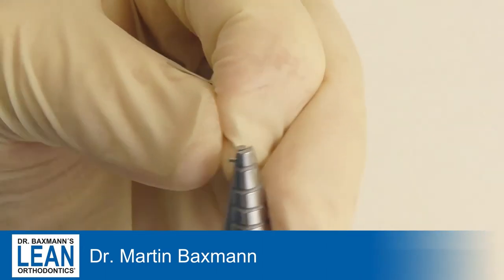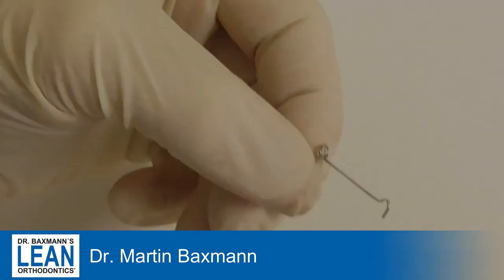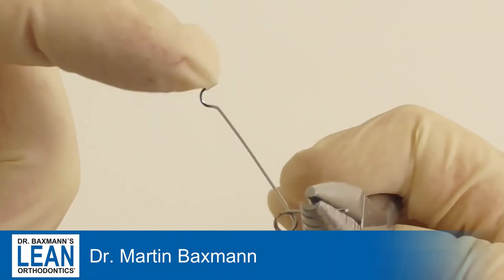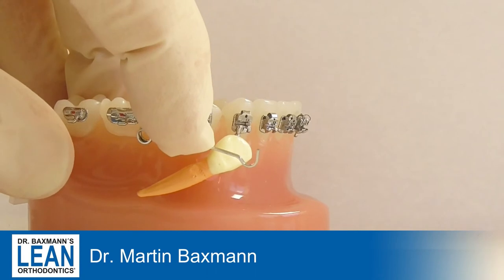Both have to point in the direction where the tooth is that you want to move. As you can see here, when you push the cantilever downwards you need to compress the double helix — that's the way it works best.